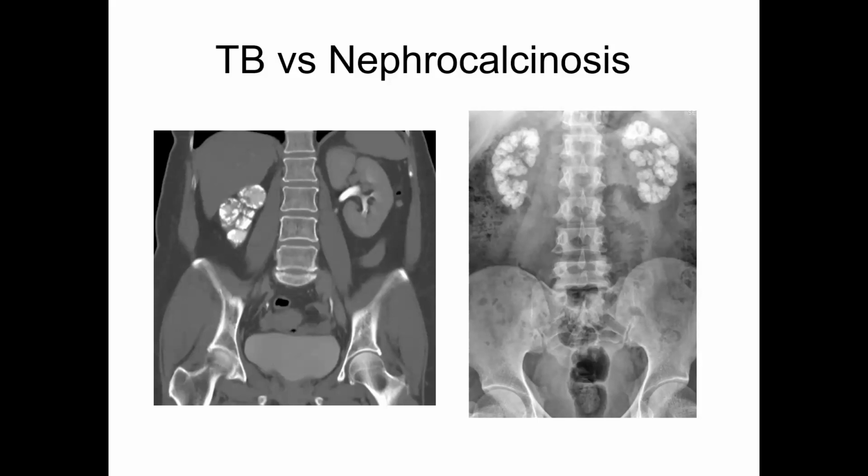Yeah, it's cystic disease of this. Actually, the cysts that you are referring to are the collecting system inside the medulla and the papillae. These cysts, the collecting system, are dysplastic, and they get dilated, and that is why they give the appearance of cysts. They undergo calcification because they are dysplastic collecting system inside the medulla. That is why you have these calcifications inside the medulla. You see, the cortex is spared here. You have calcium deposition inside the medulla.